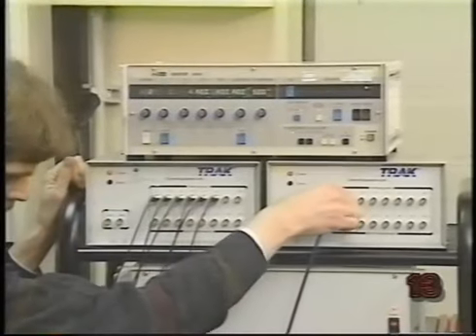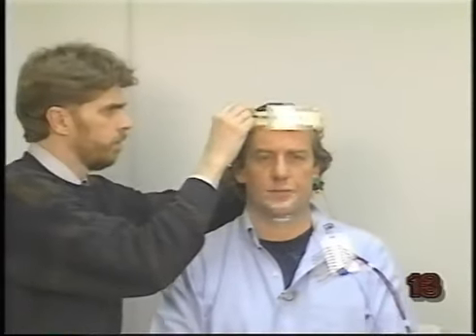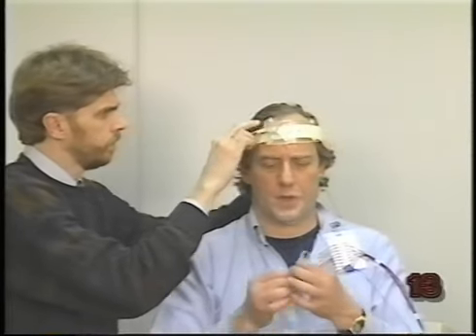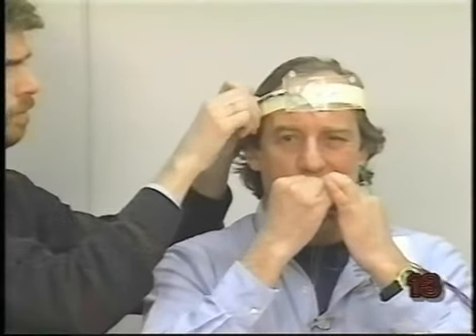The next demonstration shows a cheerful subject with surface electrodes already in place for transducing EMG activity of various orofacial muscles. A rigid head mount is used to remove the distorting effects of head motion on the lip and jaw data. Instead of placing markers on the chin, whose soft tissue may move independently of the jaw, a rigid splint is fitted to the lower teeth.